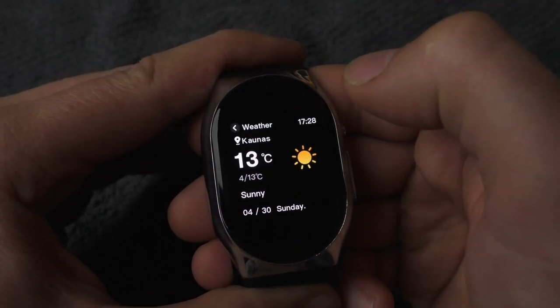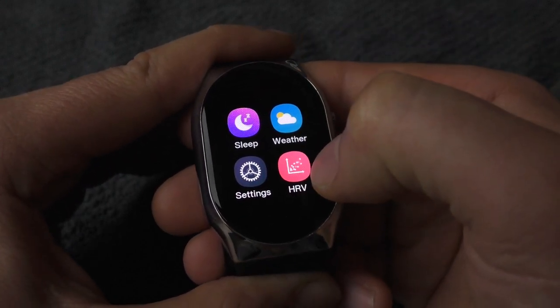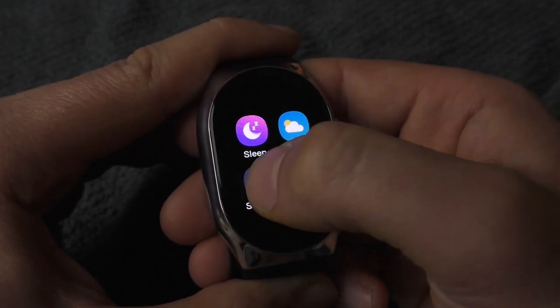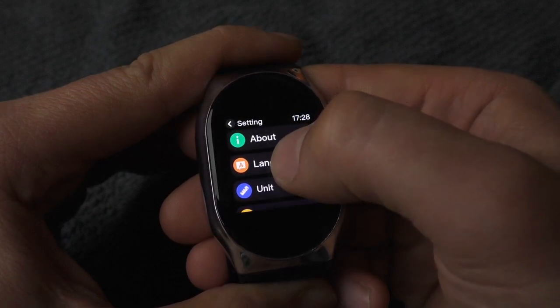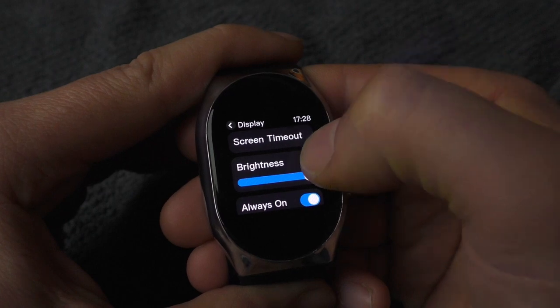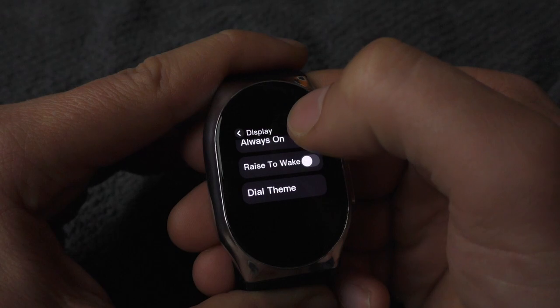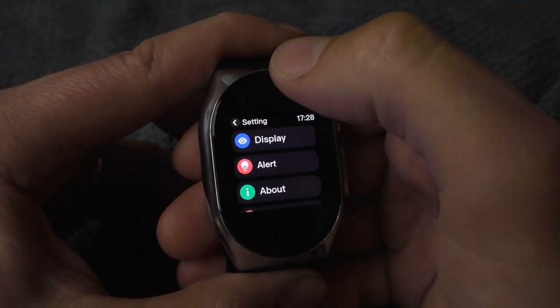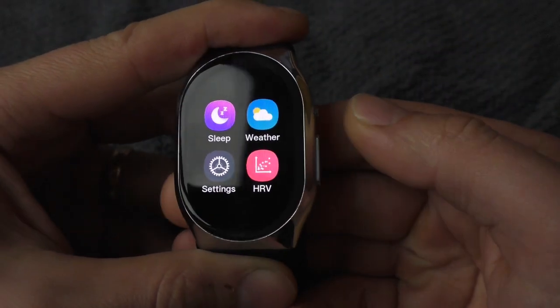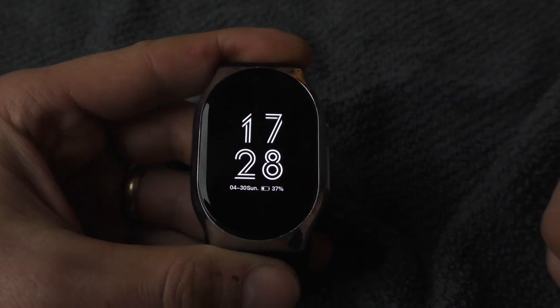It also has some workout functions, alarm, and a weather function that shows the current weather in your location. It also tracks HRV while you sleep. In the settings, you can change the language, units, and importantly, you can set the display to always on or raise-to-wake — when you flip the wrist, it turns on. If you want to turn off the display, just press the little button. It's very simple.